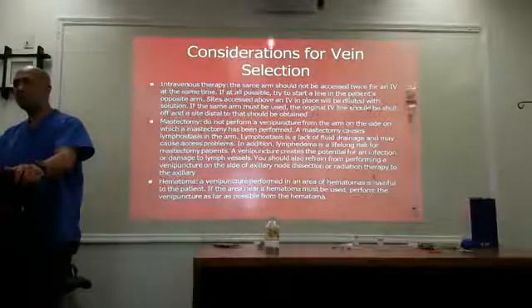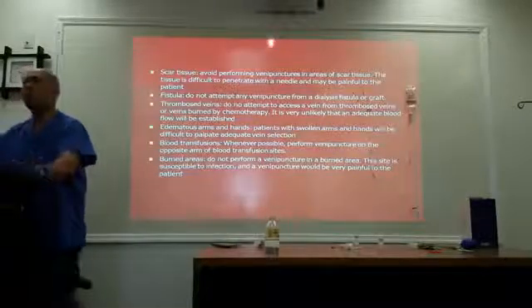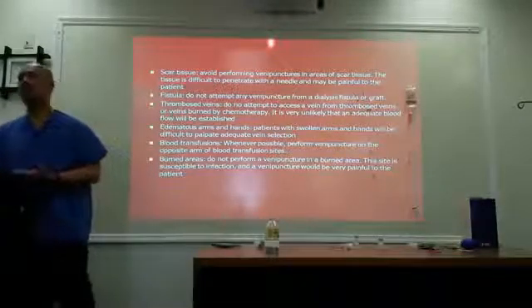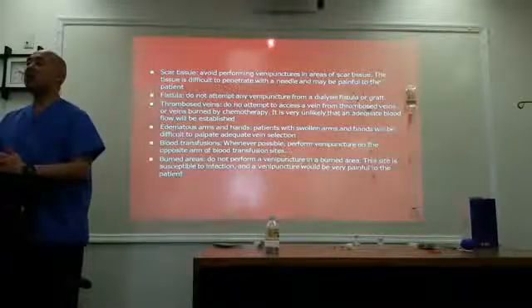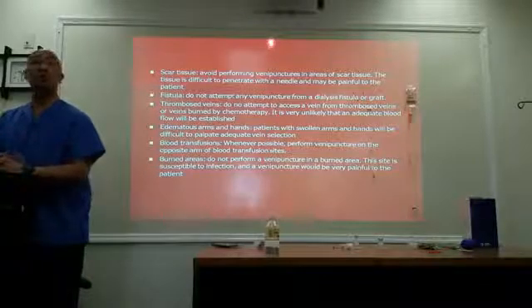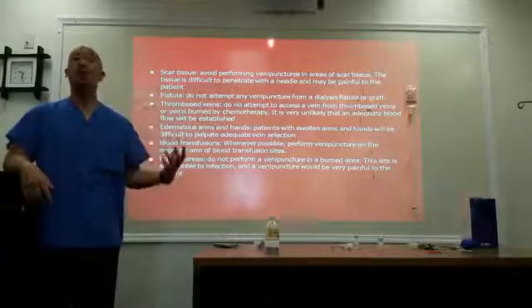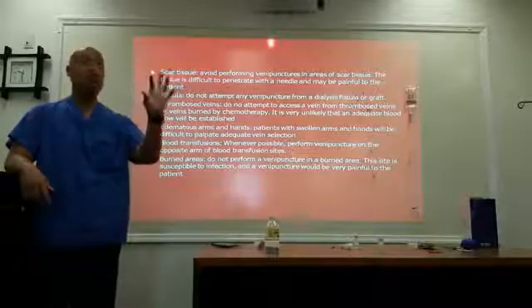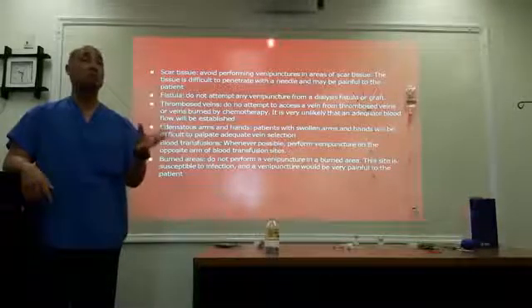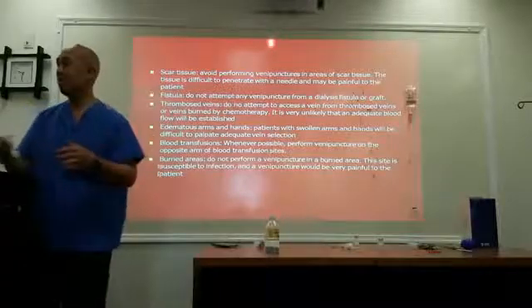All right, so consideration, hematoma. We talked about hematomas, okay? Avoid hematomas. Blood transfusion. Whenever possible, perform venipuncture on the opposite arm of blood transfusion sites. Burned area, do not perform venipuncture in a burned area. Not only is it sensitive and painful, but what happens to a burned area? Yes, infection. That area is highly susceptible to infections. So you want to avoid that area altogether.